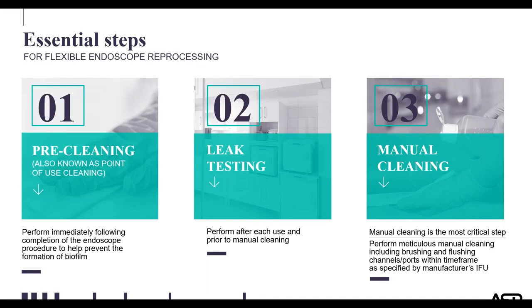I was in a decontamination room, and a registry technician was working that day. And he was cleaning a flexible bronchoscope for sterilization. I noticed he had not leak tested the device or used proper size brushing for cleaning. When I asked him about it, he stated, "I know what I need to process this scope, but they don't have what I need, so I'm using what I have."